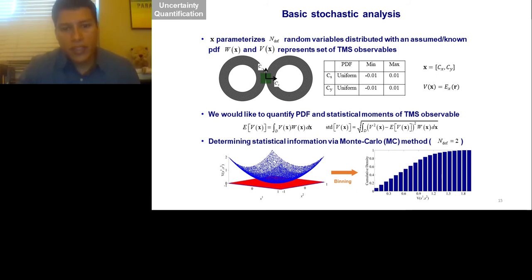And then for each of these positions, we can run a simulation to come up with the electric field that's generated at a targeted cortical site. And then once we have this ensemble of electric field simulation results, we can just compute statistics on them to derive probability density functions, cumulative probability density functions, and then we can extract means, standard deviations, and other statistical parameters.